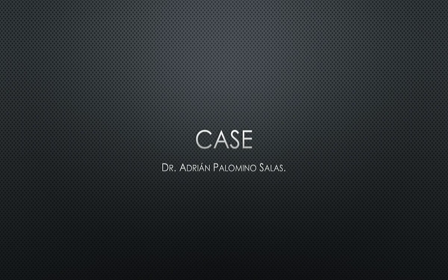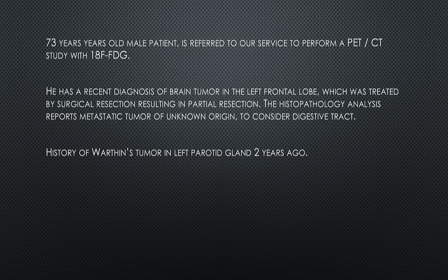Okay, this is the last case. My name is Adrián Palomino Salas, and I show you a case of a 73-year-old male patient. He was referred to our service to perform a PET-CT study with 18 FDG. He has a recent diagnosis of a brain tumor in the left frontal lobe, which was treated by surgical resection, but the resection was partial. The histopathological analysis reports a metastatic tumor of unknown origin, but suggests a digestive tract origin.